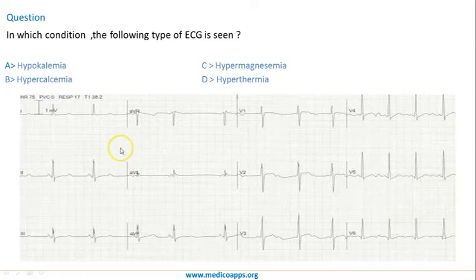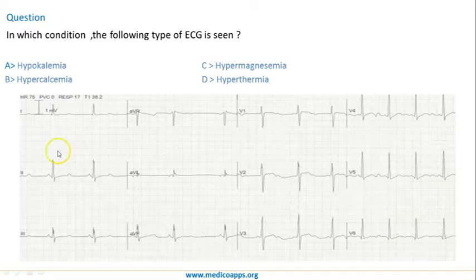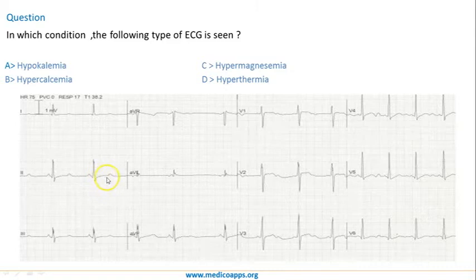Even though there is a slowing of heart rate, if you see the QT interval — normally 9 to 11 small squares — in this case measuring from the start of the Q wave to the end of the T wave, we can count 1, 2, almost 3 large squares, around 14 small squares. Definitely the QT interval is prolonged.